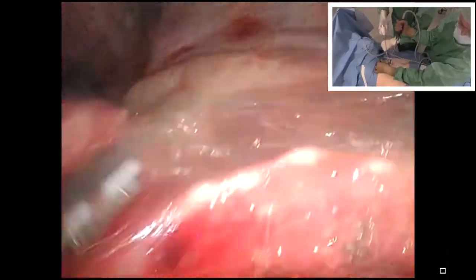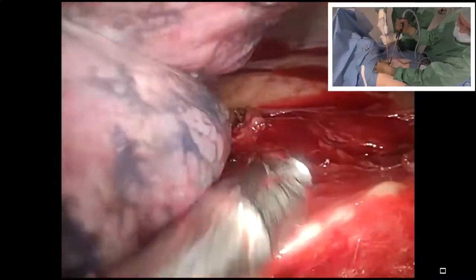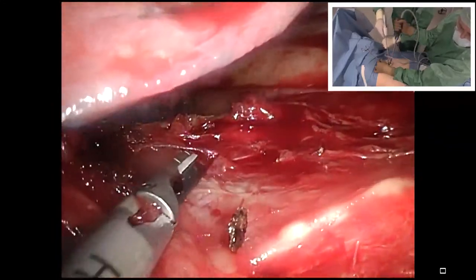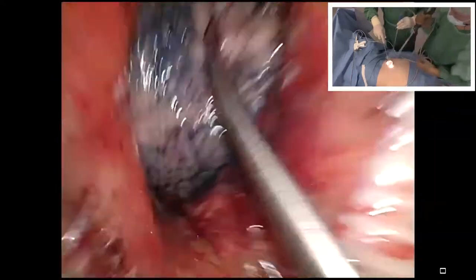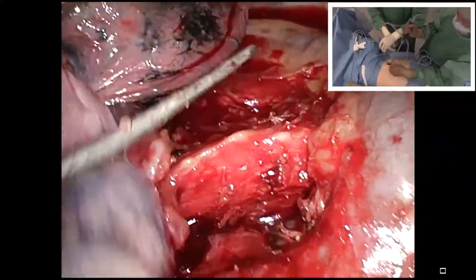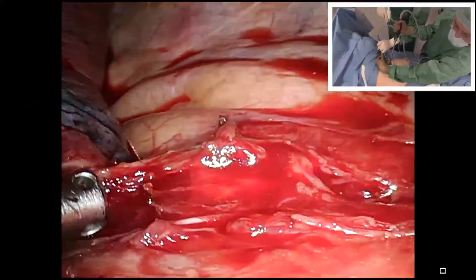Yes, this is a point where you are saying Robert Serfolio will do it every time. Yes. Well, again, during a live case in Milano with Giulia Veronese, doing it with a XI robotic device, Robert Serfolio insisted on, "Please show me the posterior aspect." She said it's not urgently necessary, but he said, "No, stop, show me the posterior aspect." So therefore, I always include this aspect. There's something in it to see the posterior division of the main bronchus and upper lobe, and in that case for bronchoplastic, it should be nice.